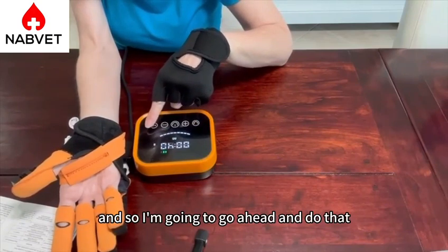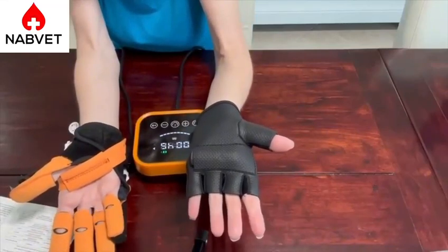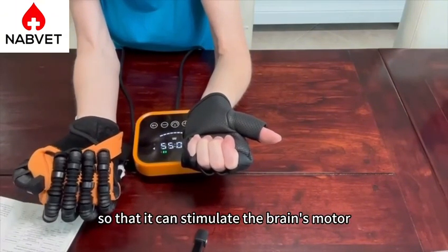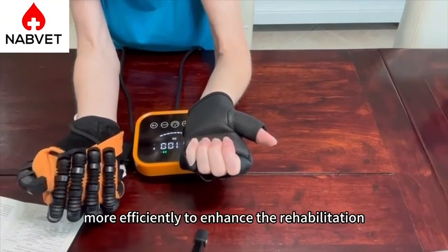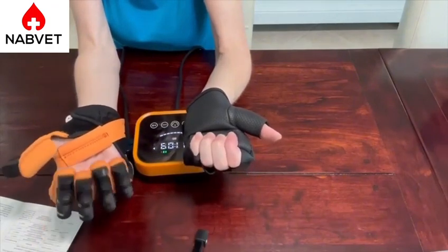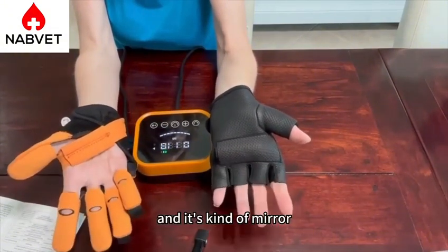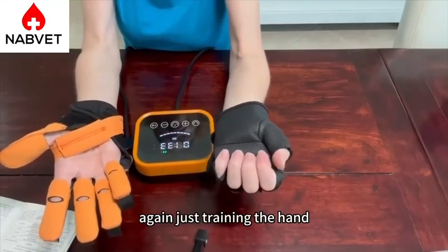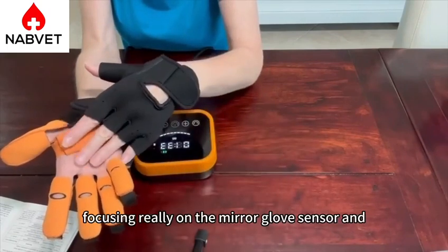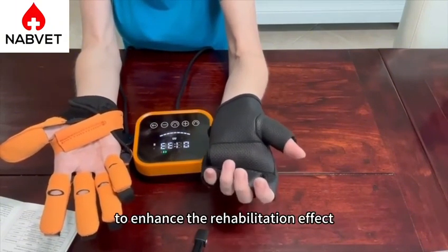We're going to hit the pause and go ahead and do that. What you're going to do is actively focus on the mirror motion of the hand during the left and right hand bearing image, so that it can stimulate the brain's motor central nervous system more efficiently to enhance the rehabilitation. When you take your hand off, you're going to find that the glove opens up. Push it on and it's going to mirror. Take it off and it's going to mirror. This is really great for training the hand to open and close, focusing on the mirror glove sensor, and then actually focusing on the hands mirroring it so that you can stimulate your brain motor central nervous system more efficiently to enhance the rehabilitation effect.